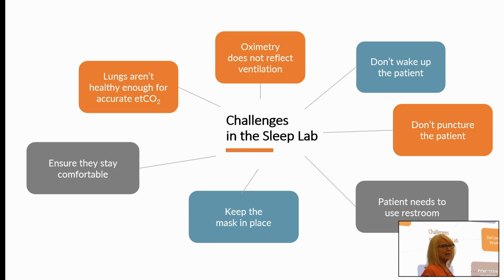And you know that you can't always rely on your end-tidal values to be accurate, especially in patients that we see in our sleep labs. You also want the patient to remain comfortable, to be able to get up and use the restroom without much hassle. So transcutaneous monitoring can provide this continuous monitoring and help you overcome a lot of these issues that you see in the sleep lab so that you can get a good study.